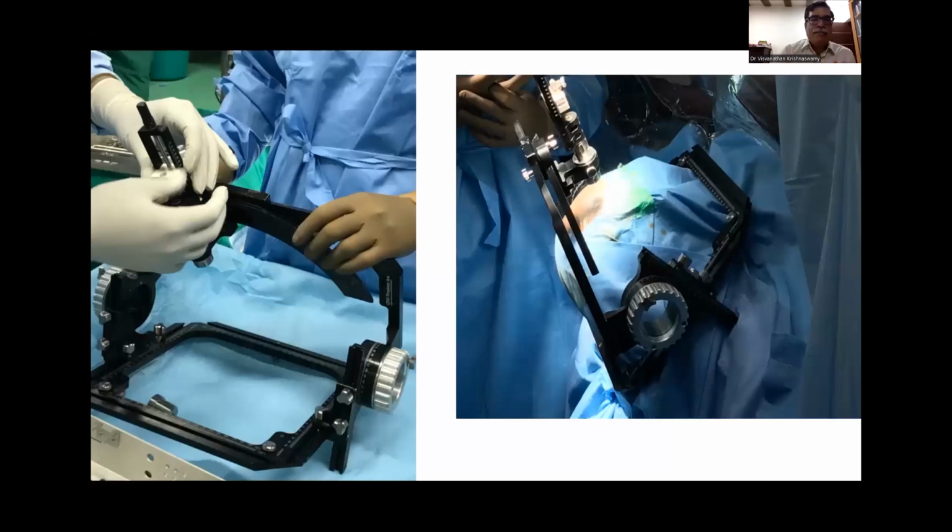Now here we are assembling the arc of the frame. We choose one side, which is usually the worst side first, and then the other side. Generally the patients are elderly, and they need to be cooperative. So we start with the worst side, and then if the patient is too tired to cooperate on the best side, that would be a better trade-off.